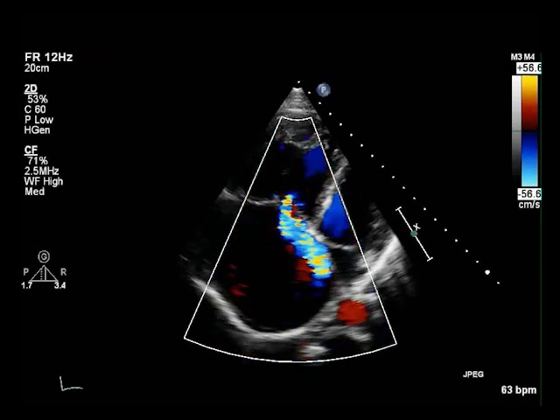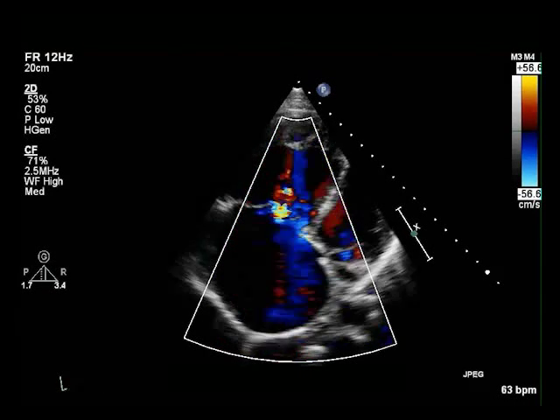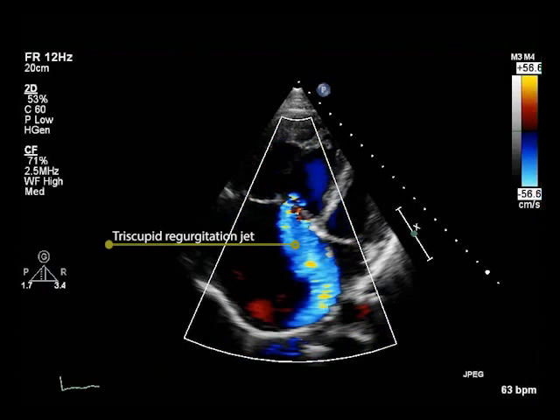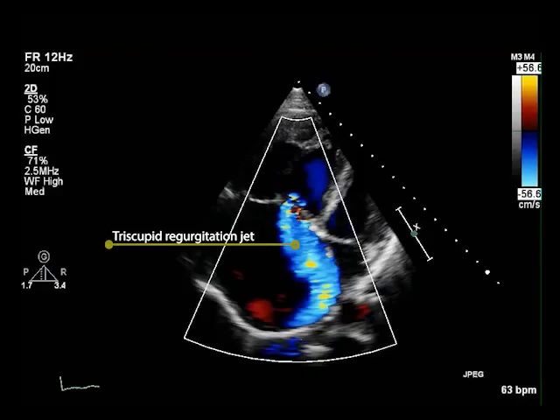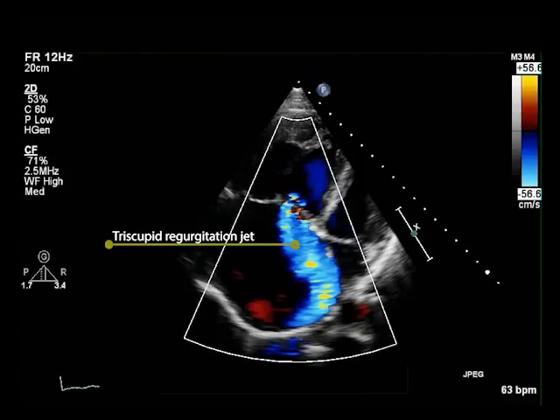In order to calculate pulmonary vascular resistance, or PVR, we need to determine peak tricuspid regurgitant velocity, or VTR, and the velocity-time integral of the right ventricular outflow, or VTI RVOT.